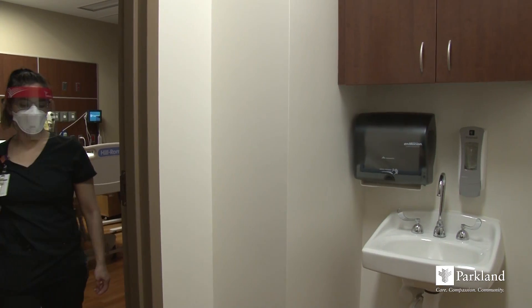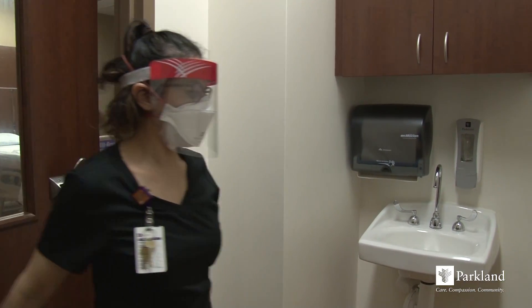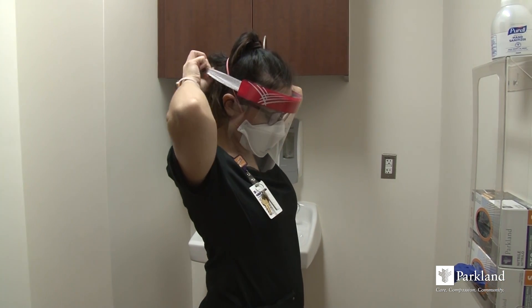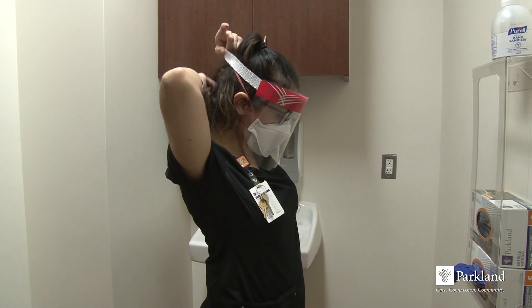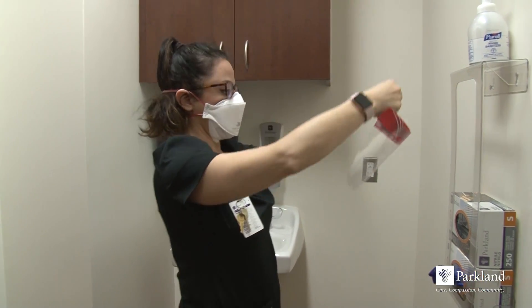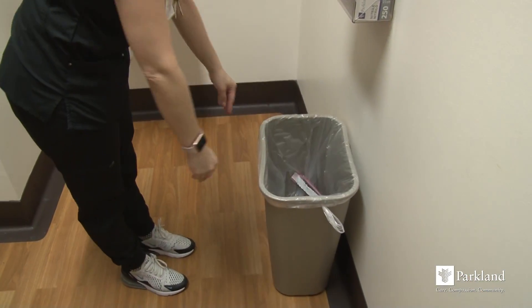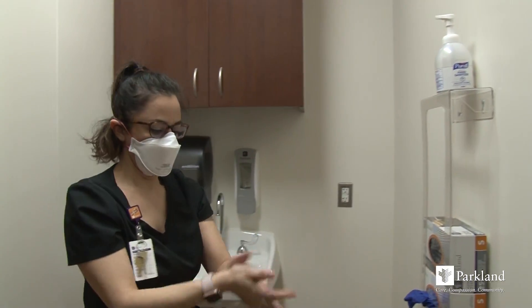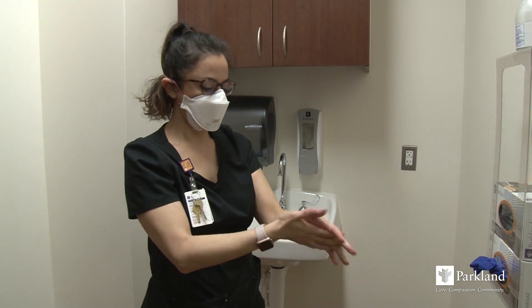Outside the patient zone and with clean hands, you may now begin to remove your respirator and eye protection. Remember the outside of your face shield and mask are contaminated. Remove your face shield by grasping the headband as far back as you can and remove away from your face. To remove your goggles, grasp the ear handles and remove them away from your face. Discard after disposing your eye protection in the waste bin, then perform hand hygiene again before handling your respirator.